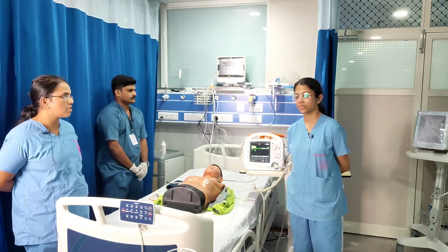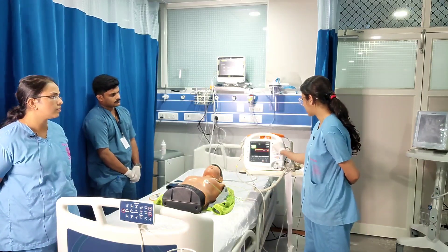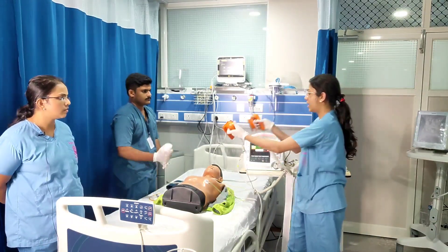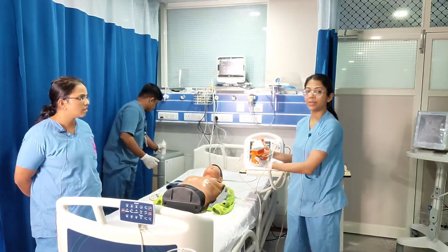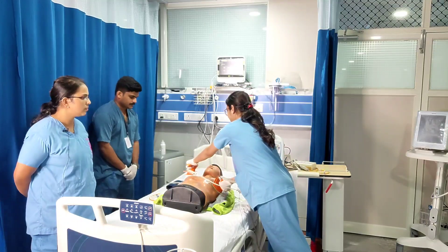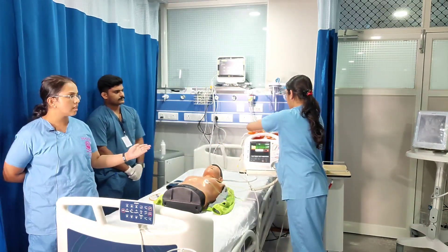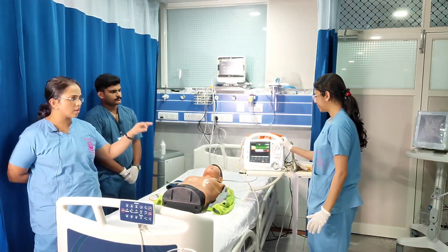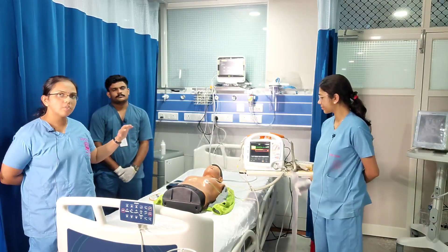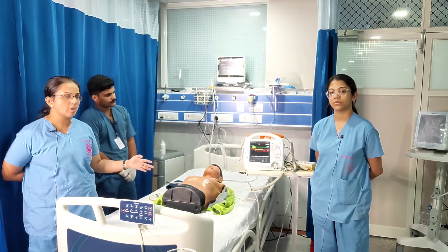Since it is a wide complex regular tachycardia, I will select 100 joules and press the sync button for synchronized cardioversion. Apply conductive jelly and place the paddles. The patient has already been explained the procedure and sedated. Press the charge button, all clear, and hold for about 10 seconds so the shock is delivered. In synchronized mode, the shock is delivered at the peak of the R wave of the QRS complex.